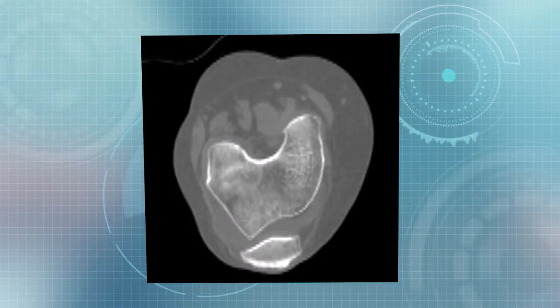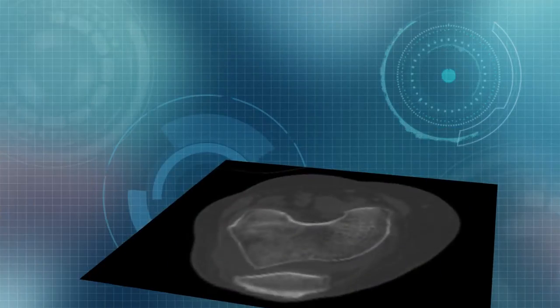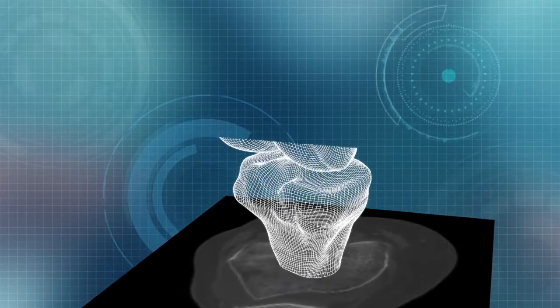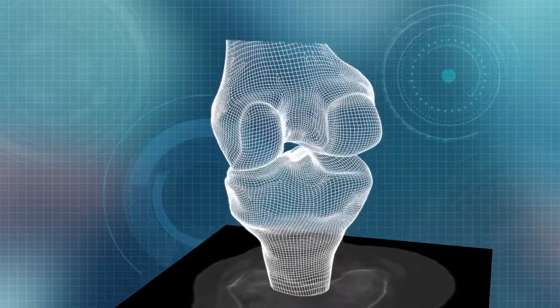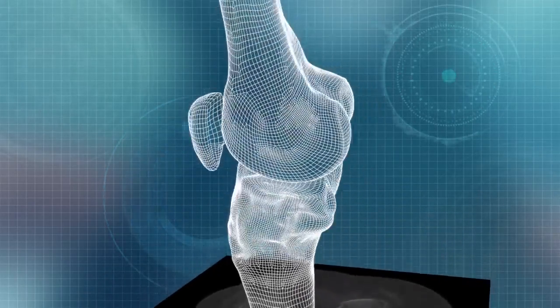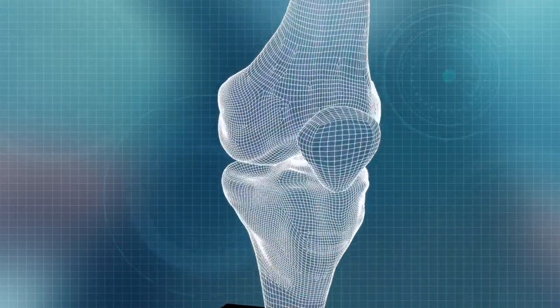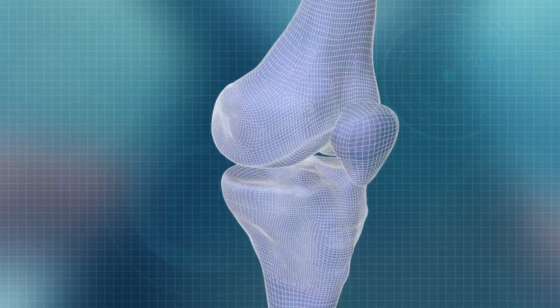The proprietary iFit software converts the two-dimensional CT data into a three-dimensional model that replicates that patient's unique anatomical bone geometry.